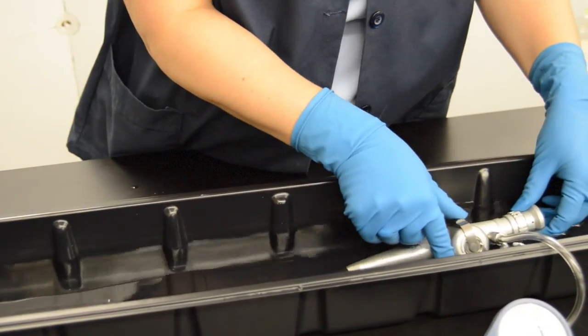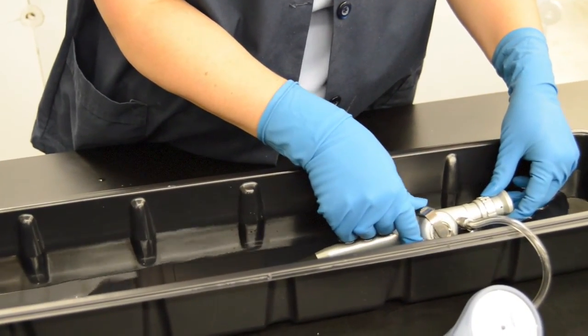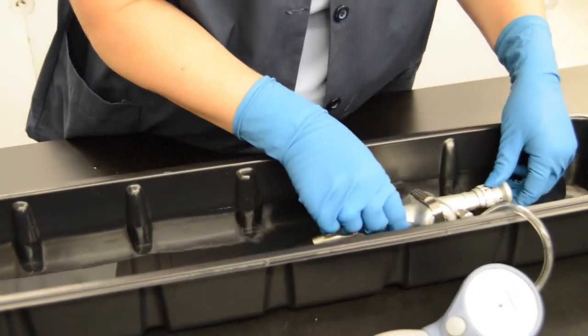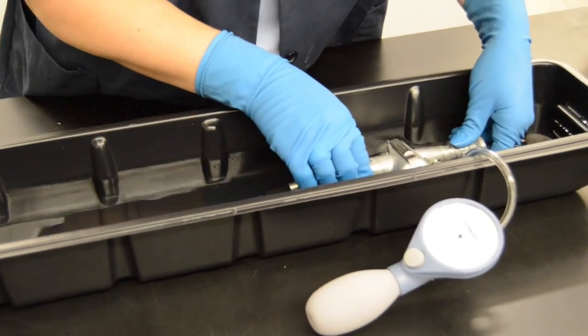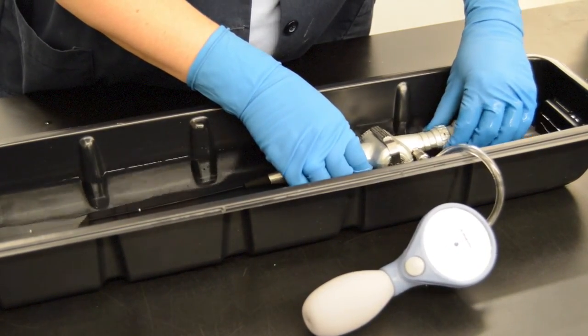A steady stream of air bubbles indicates a leak in the endoscope. Remove the scope immediately from the water while the scope is still pressurized. Air escaping the endoscope at the leak site will have prevented fluid invasion.